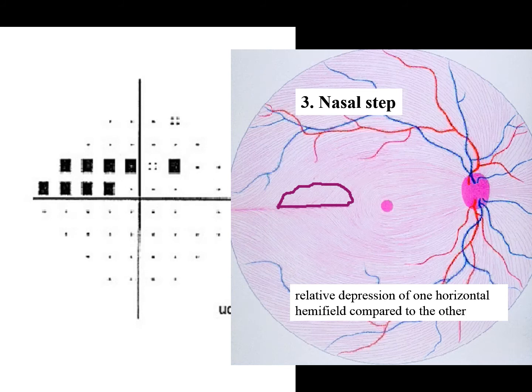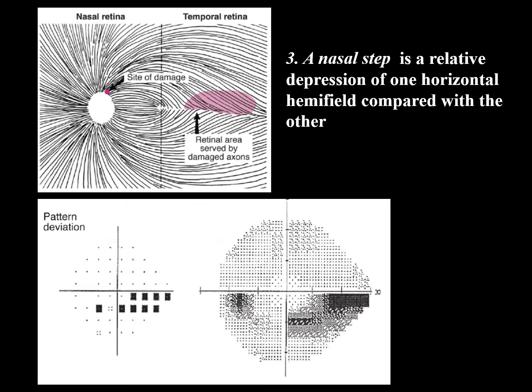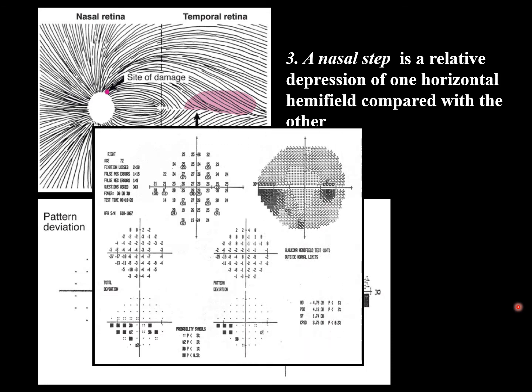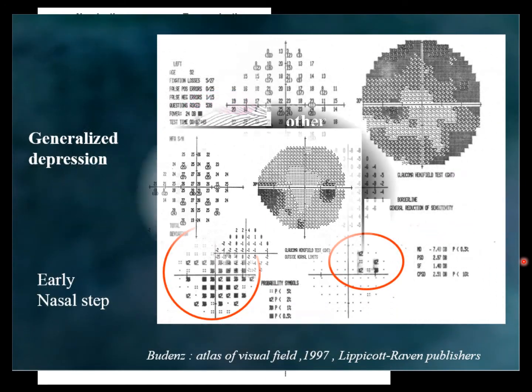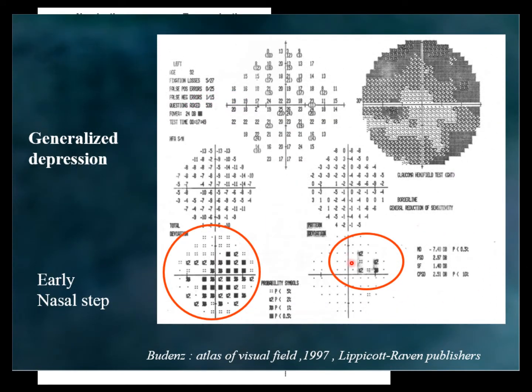Third, we have the nasal step. You can diagnose a nasal step if you have changes in one of the hemispheres and no similar changes in the opposite hemisphere, as in this example. Again, we see something here on the nasal area and nothing in the opposite hemisphere.